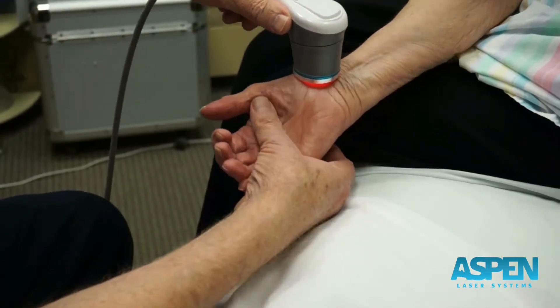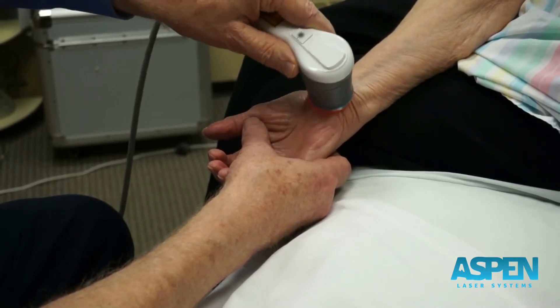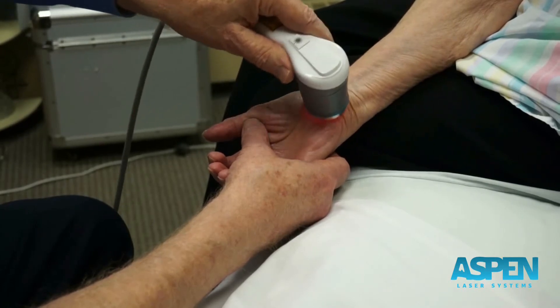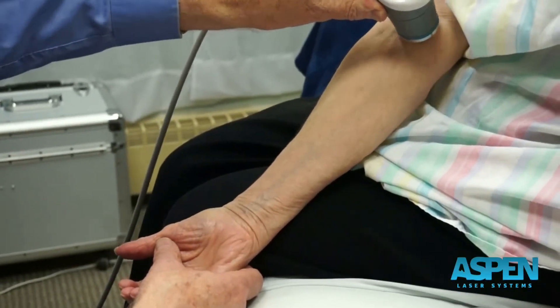Sometimes I'll take and spread the wrist out — like if we're doing carpal tunnel, open that up so you can get in there right over the tunnel — and then trace the median nerve back up to the pronator teres and all the way to the elbow.